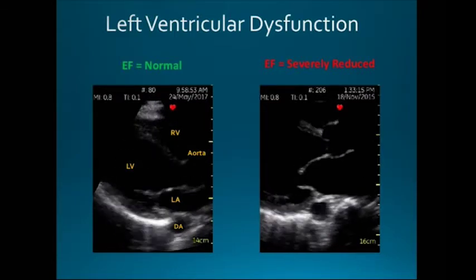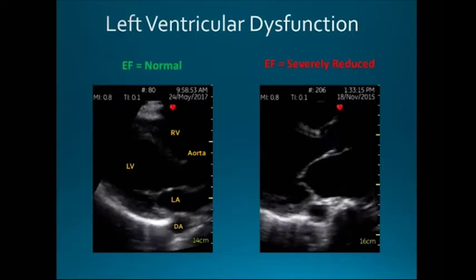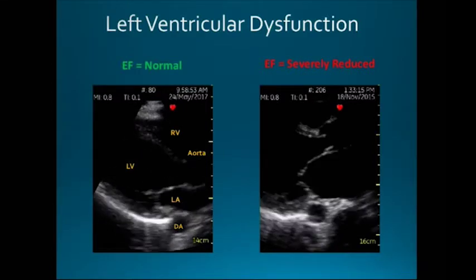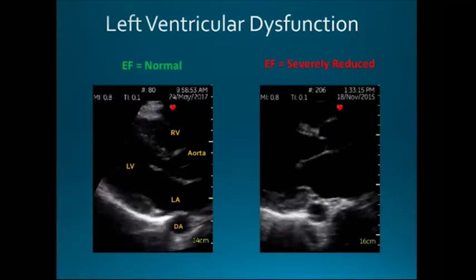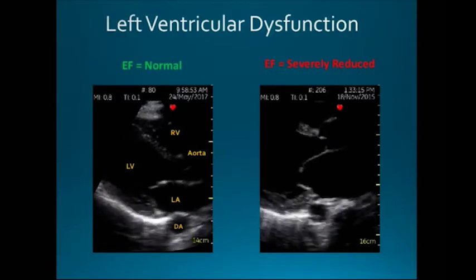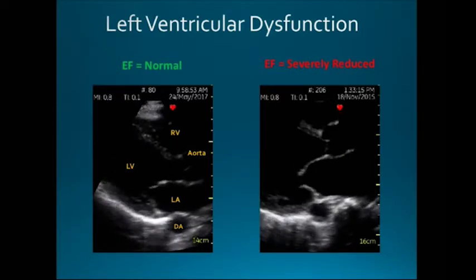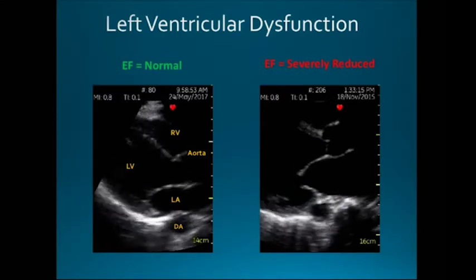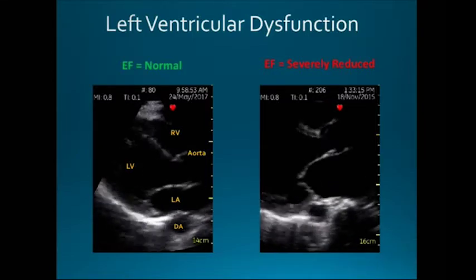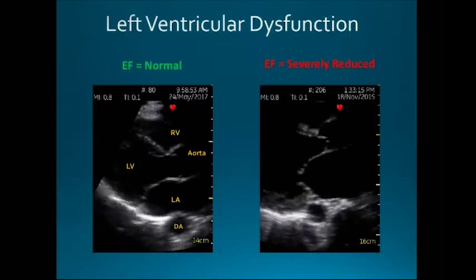So what do you guys think the distance between the valve tip to the septum is in this patient here? It's like 3-4 centimeters, right? It's clearly more than 1 centimeter. You can very quickly diagnose somebody with LV dysfunction. And many people that I look at have hearts that look like this, and they actually have skinny little ankles, and they're relatively asymptomatic until they sort of acutely decompensate. And so this is how you can just rapidly get one picture of the heart and then use one little dirty shortcut and pick up a lot of people with severe LV dysfunction. Just that 1 centimeter little cut point.